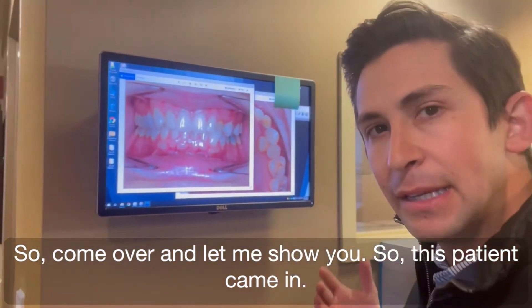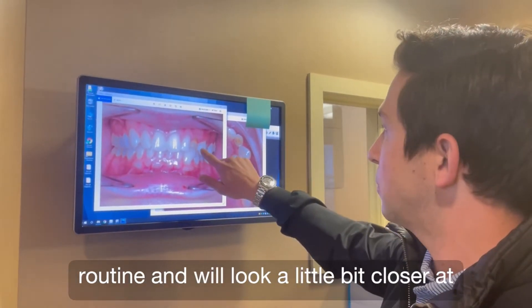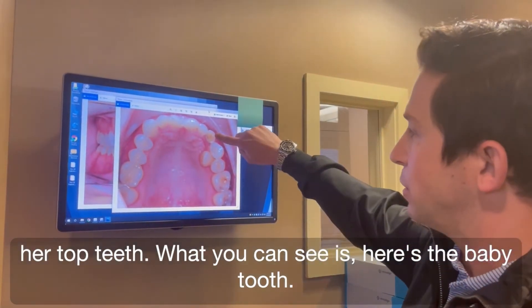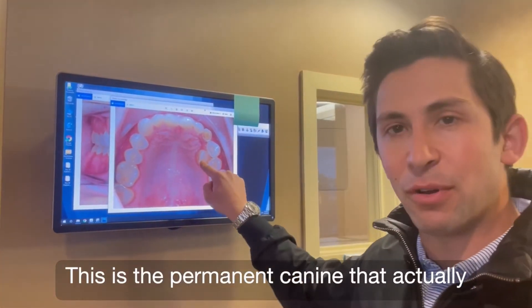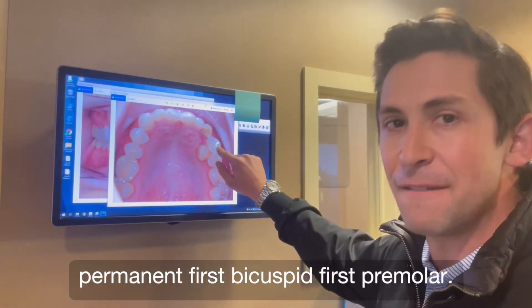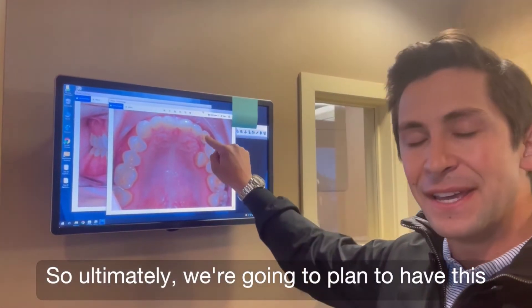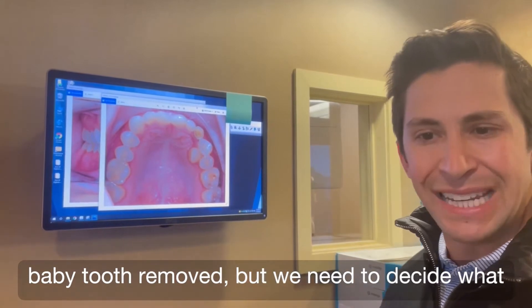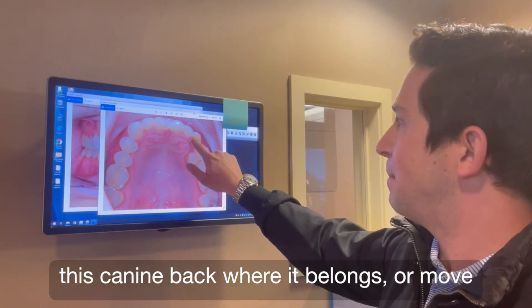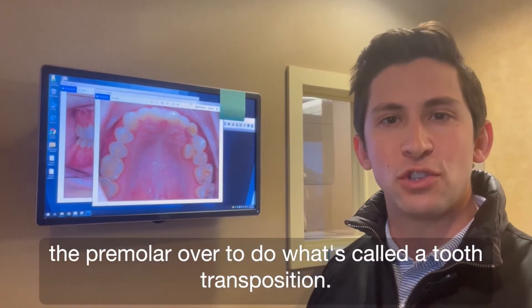So this patient came in — she's an adult. She has a baby tooth that was over-retained, and we'll look a little bit closer at her top teeth. What you can see is here's the baby tooth, this is the permanent canine that should be sitting right here, and this is the permanent first bicuspid — first premolar. Ultimately we're going to plan to have this baby tooth removed, but we need to decide what to do about these two teeth — whether to move this canine back where it belongs, or move the premolar over to do what's called a tooth transposition.